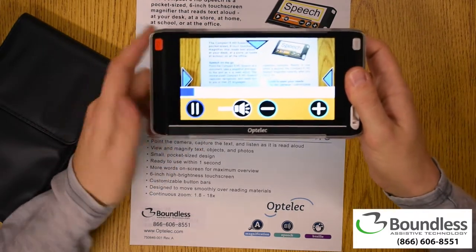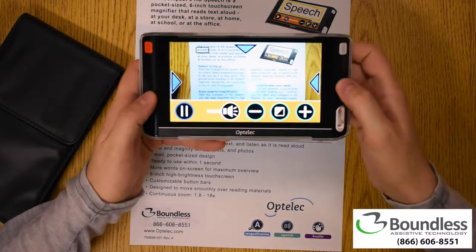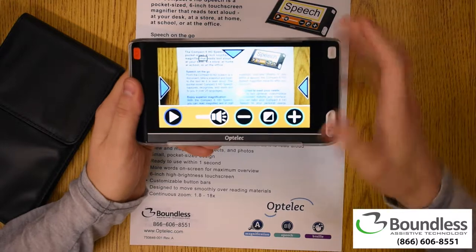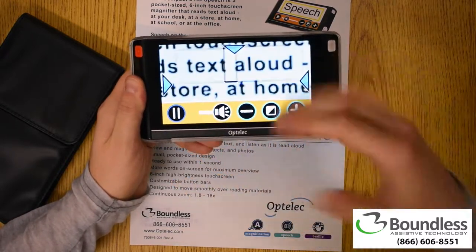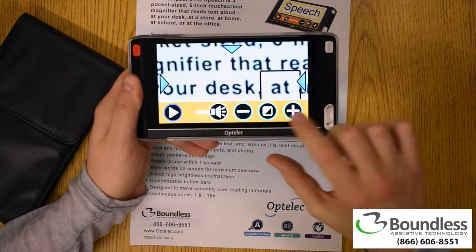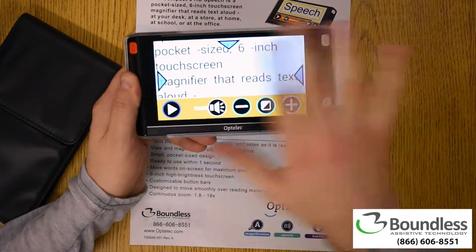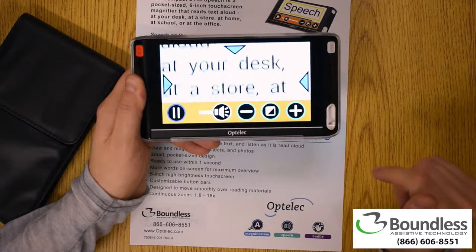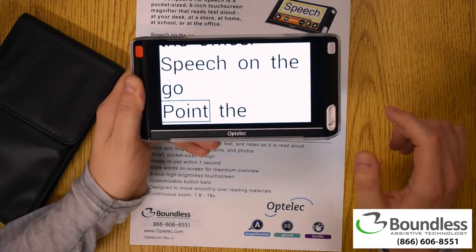I can go ahead and press play now and it's going to start reading to me. The accuracy is incredible. I can zoom in, press play, and follow along with it. You can see these are the actual pictures, so it may look a little blurry, but I can enhance that and actually change it to a computerized version of those same words, making it much more easy to follow along and much more easy to see.